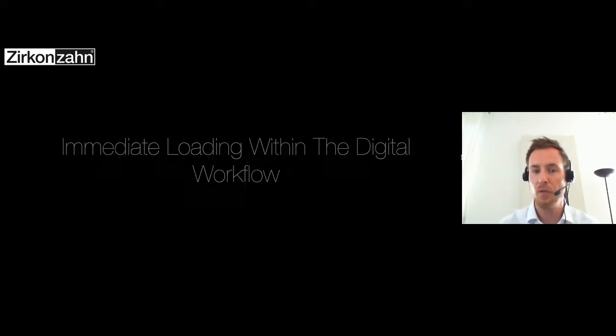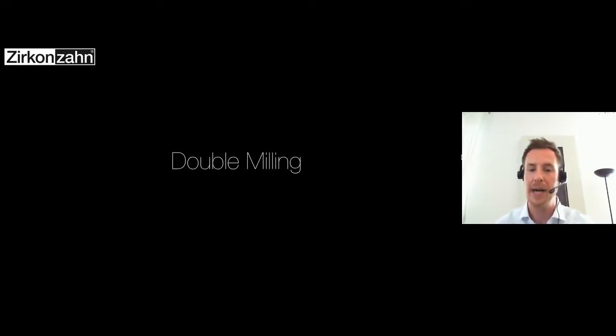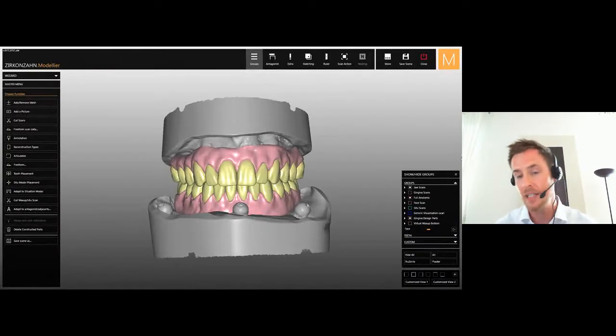So now the last minutes, we come to the immediate loading workflow, only a few words about that. We have a special workflow, and this is unique worldwide. No other company can do that or provide that. This immediate workflow is called double milling. So the words are saying already, double milling, I mill something twice, but it's separated in upper and lower part.